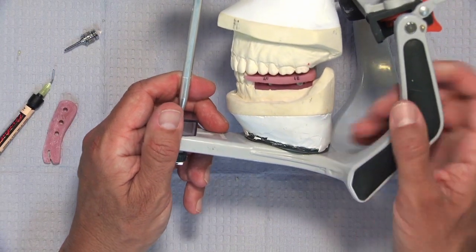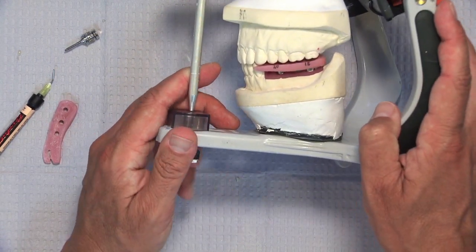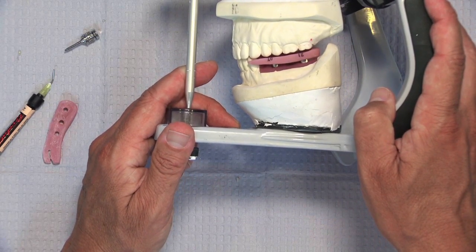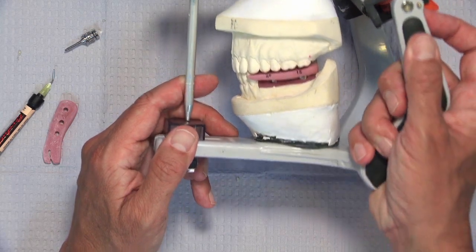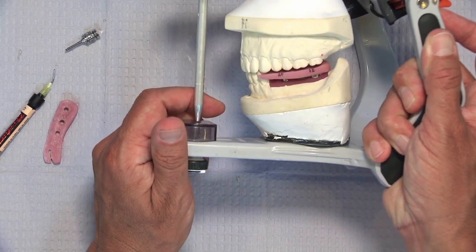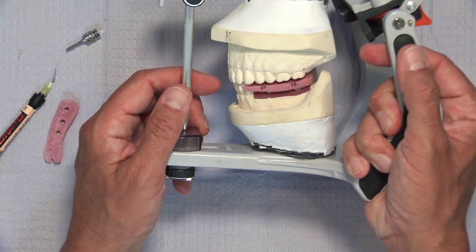If everything happens to be mounted correctly, when they bite together, it'll fit into the tooth indentations on the bite index. But the chances realistically of this happening are probably only about 5%. I would say 90-95% of the time when the patient bites together into this index, they're not going to close smoothly right into it. And that's the whole point of this appointment, is to get a more accurate bite registration.